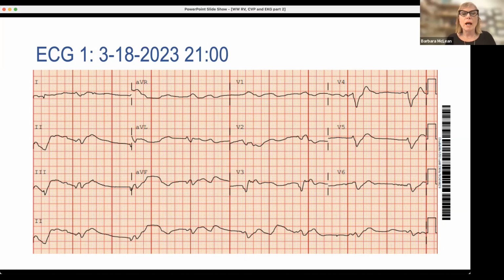Too much movement. I can't tell what's happening. Please do it again. Stop accepting such low quality when you need to look at this information. And I need a long rhythm strip. This is nice. I've got a rhythm strip, but it's really short, right?